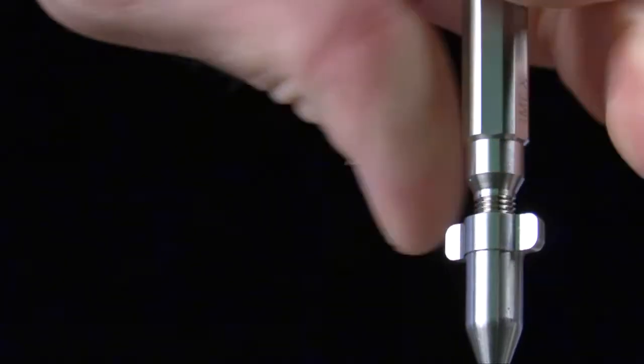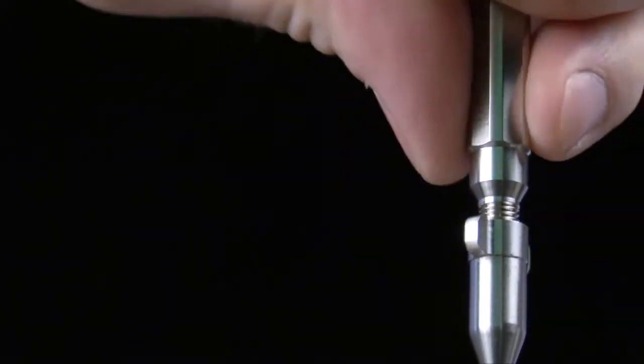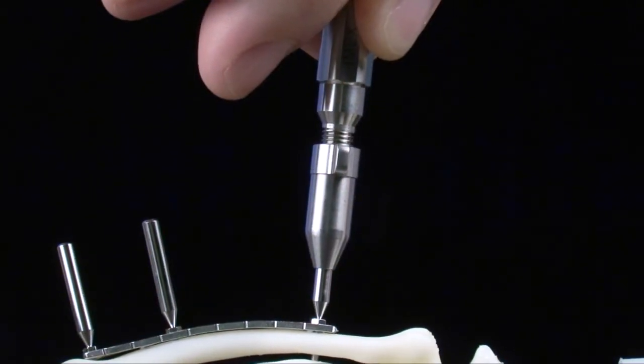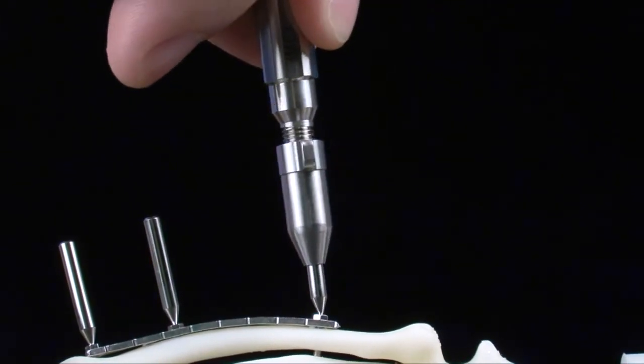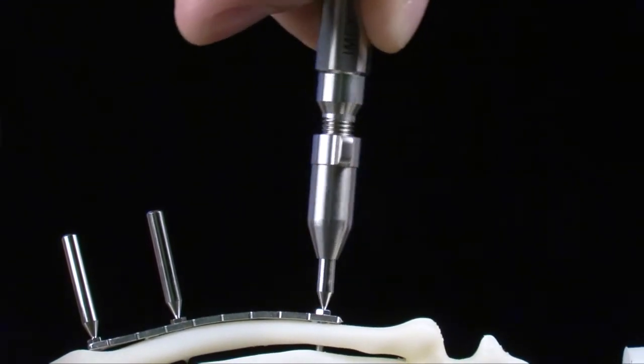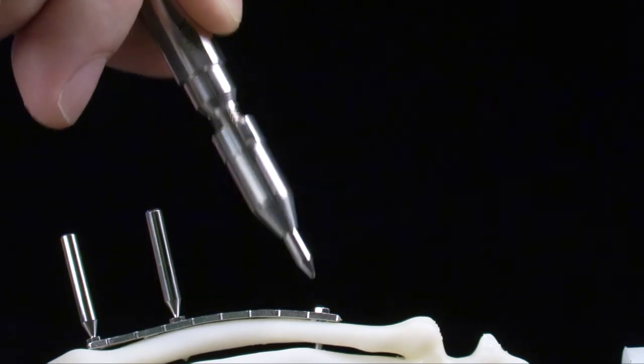With the fracture stabilized with the bone plate and several screws, the screw shafts can now be removed. Using the hex head against the plate as a fulcrum and the finger driver as a lever, rock the shaft back and forth along the long axis of the plate to remove the temporary screw shaft.